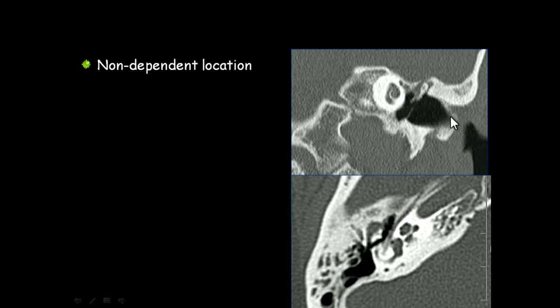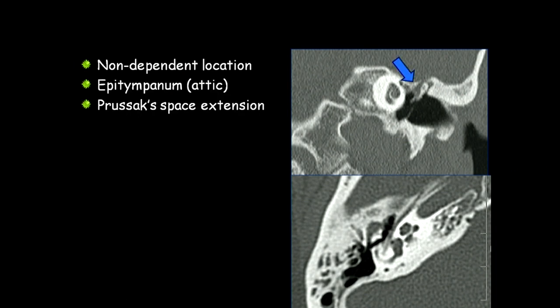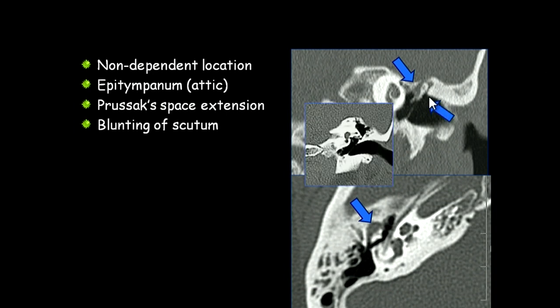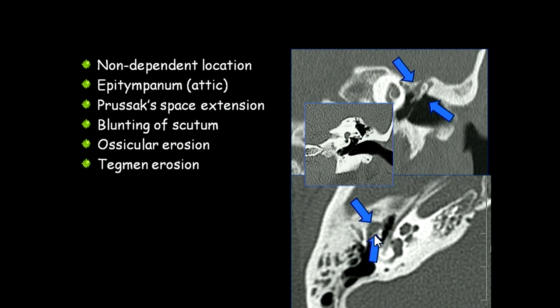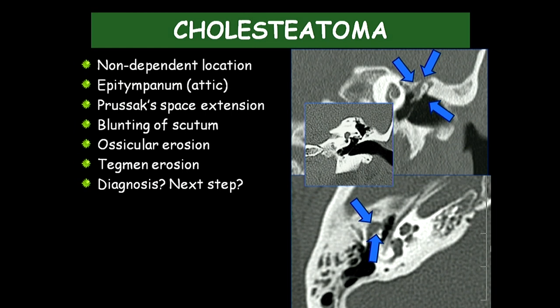Here is a soft tissue located in the attic, in a non-dependent location — actually at the Prussak's space, as you can see in the axial plane. There is blunting of the scutum; the scutum is eroded and blunted compared to a normal sharp scutum. The ossicular chain is eroded, the incus is slightly eroded, the cochlea is also unhealthy, and the tegmen is eroded — the diagnosis, which everyone knows, is cholesteatoma.